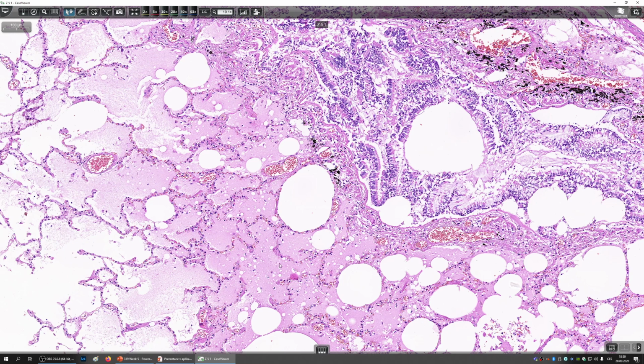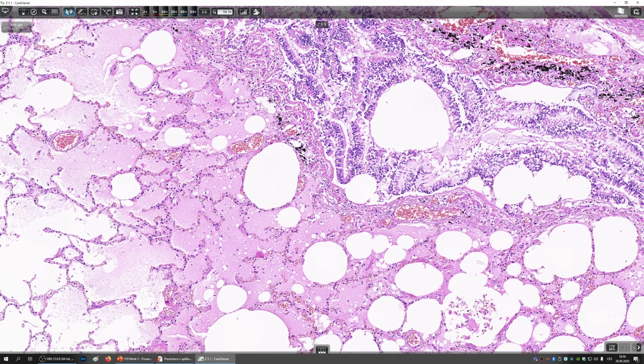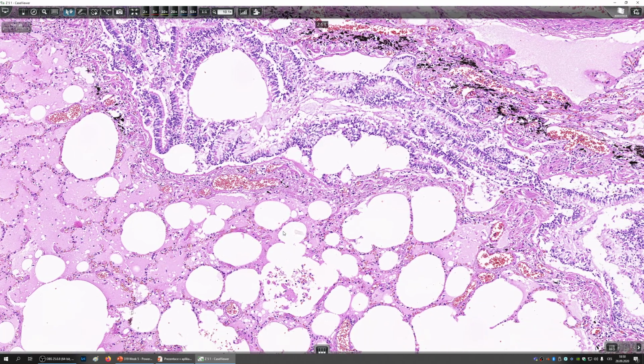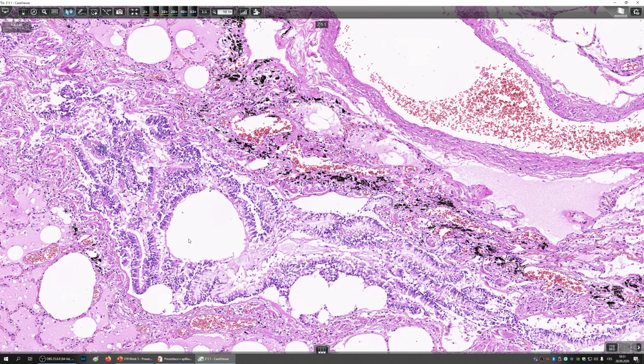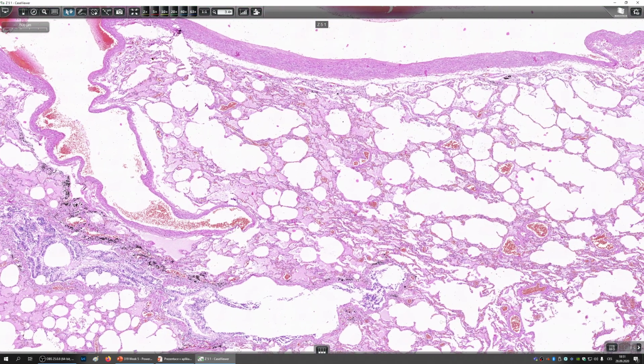In this case, this is transsudate because it is not linked to inflammation, but to chronic venostasis due to heart failure. So the edema fluid got produced in large amounts, and this patient will cough up a pinkish foamy sputum, and will be in acute distress because the patient will be dyspnoic. You see that a lot of alveoli are full of this fluid. The alveoli that are full of fluid will not be able to exchange gases.